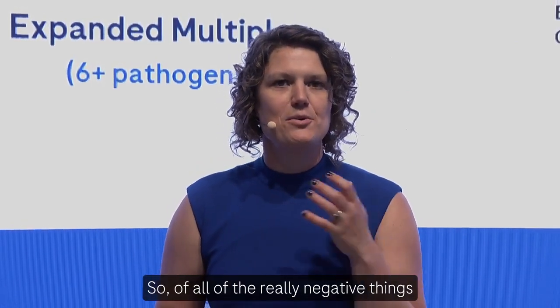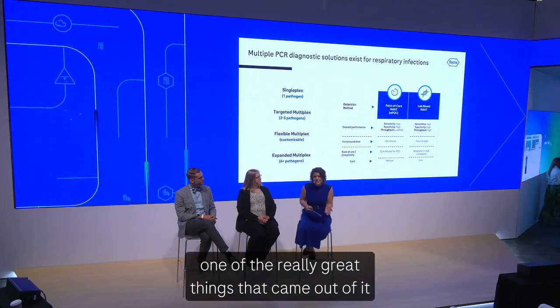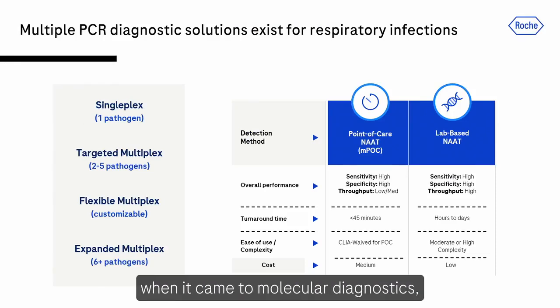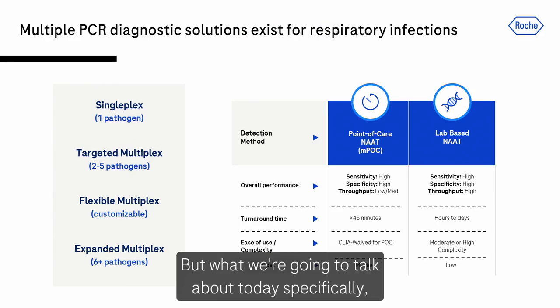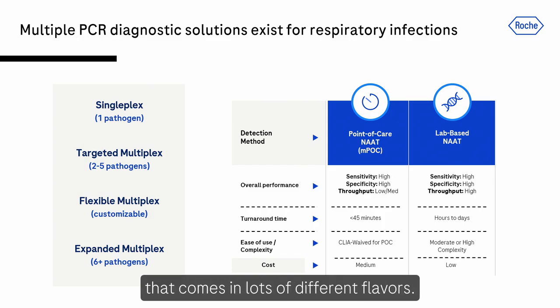Of all of the really negative things that happened during the pandemic, one of the really great things that came out of it is there was a lot of innovation when it came to molecular diagnostics, especially for respiratory infections. And there's lots of different types of technologies that we can fit underneath this umbrella. But what we're going to talk about today specifically is PCR. And PCR is but a slice of that, but it's a very rich slice that comes in lots of different flavors.